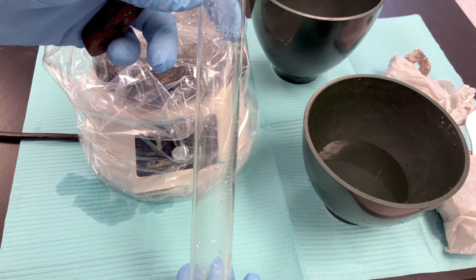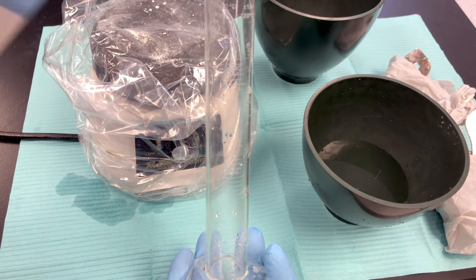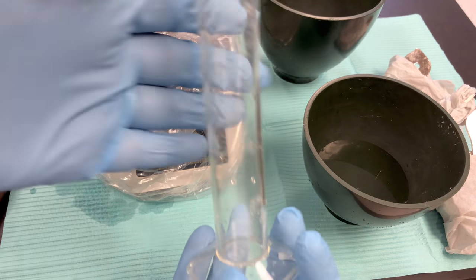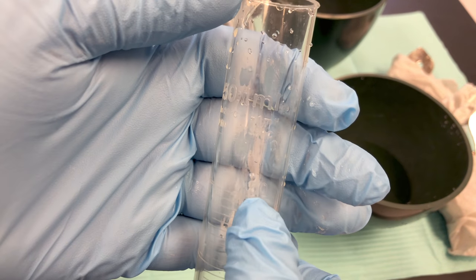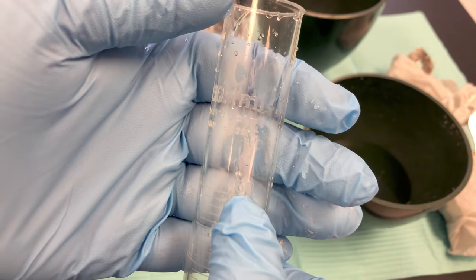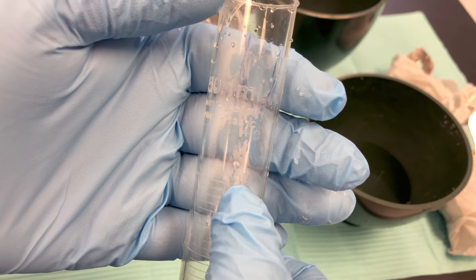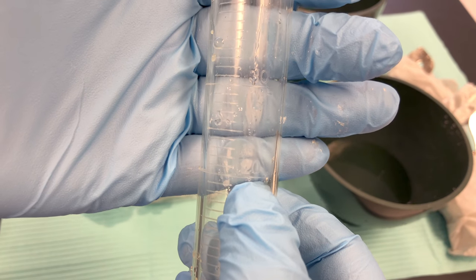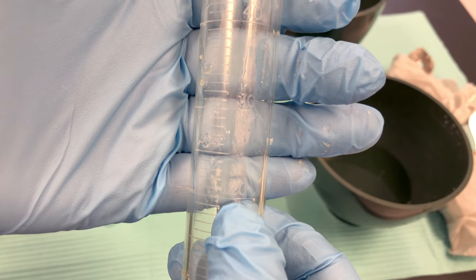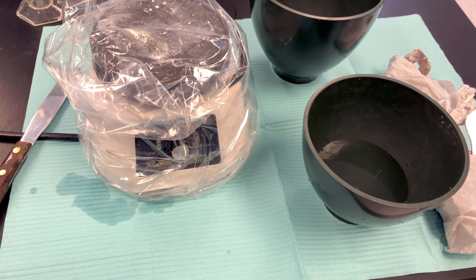I used a graduated cylinder and will be using 200 grams of powder, so I double my water measurements. If your graduated cylinder doesn't go up to 70 milliliters, you'd measure out 50 milliliters and then 20 milliliters to get your total of 70. I've already pre-measured out my water. Let's go to the scale and measure out our powder.